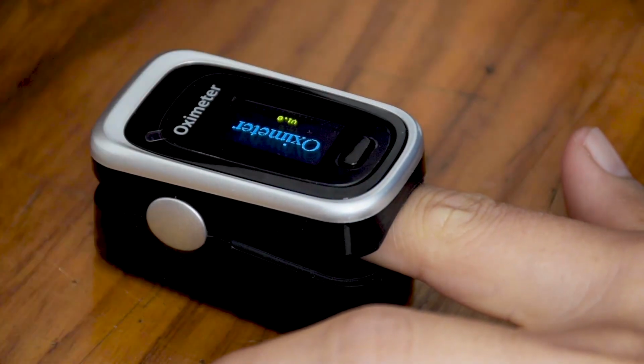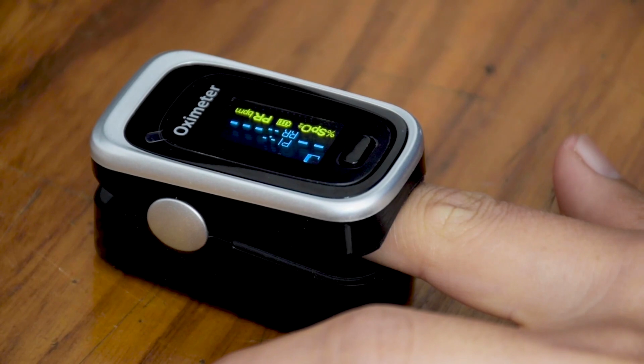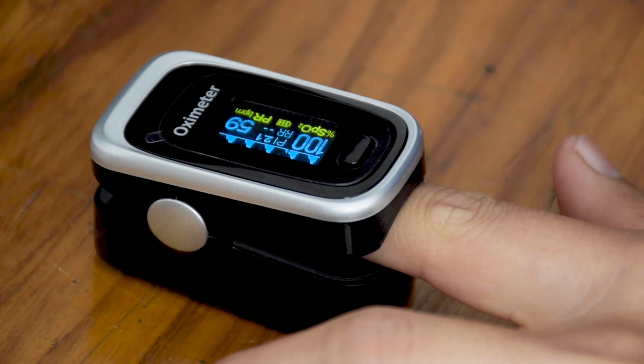The pulse oximeter provides valuable information about the oxygen carrying capacity of a person's blood and their heart rate, making it a crucial tool in monitoring respiratory and cardiovascular health.